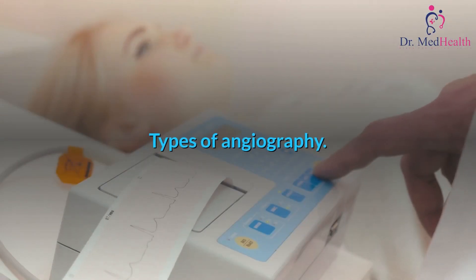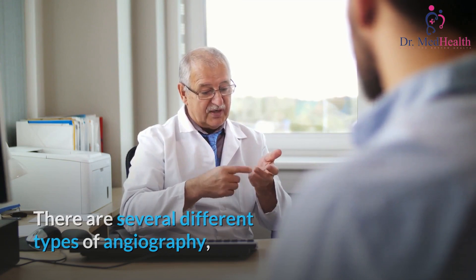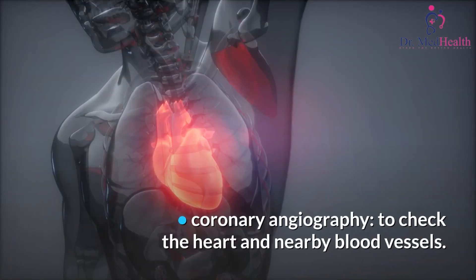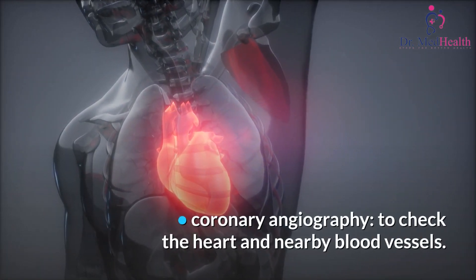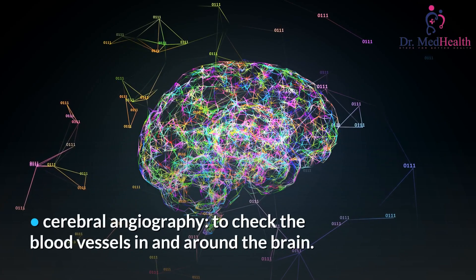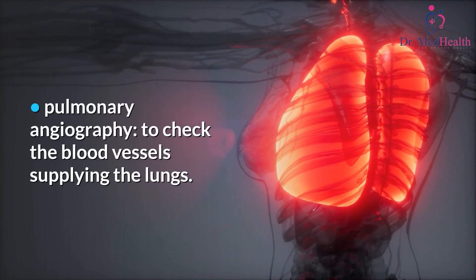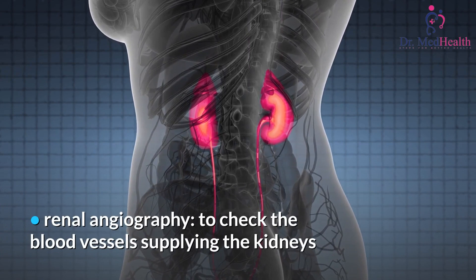There are several different types of angiography depending on which part of the body is being looked at. Common types include coronary angiography to check the heart and nearby blood vessels, cerebral angiography to check the blood vessels in and around the brain, and pulmonary angiography to check the blood vessels supplying the lungs.